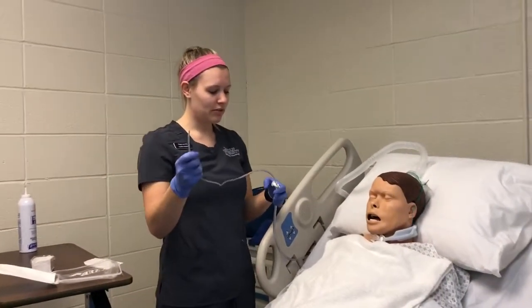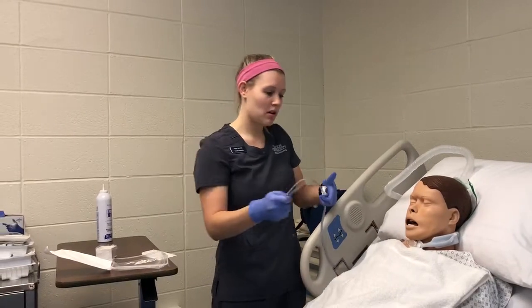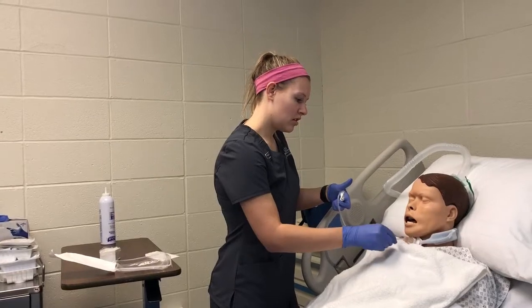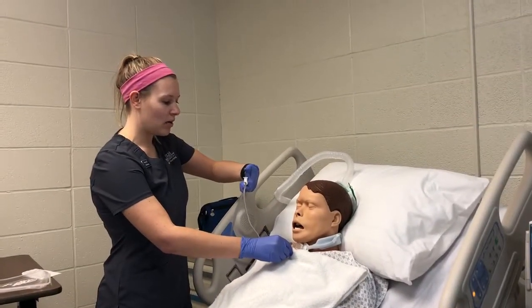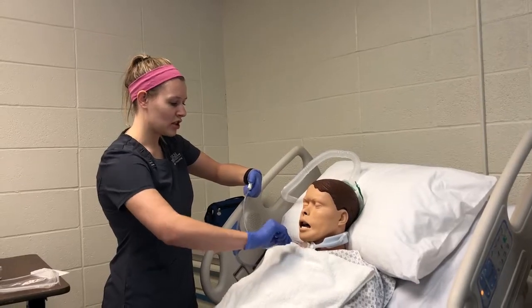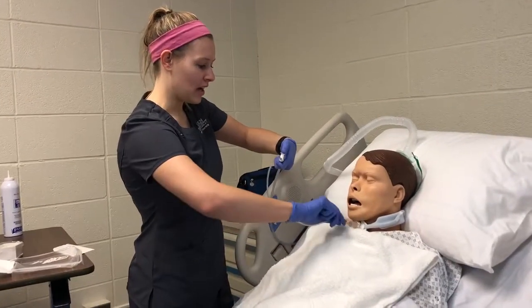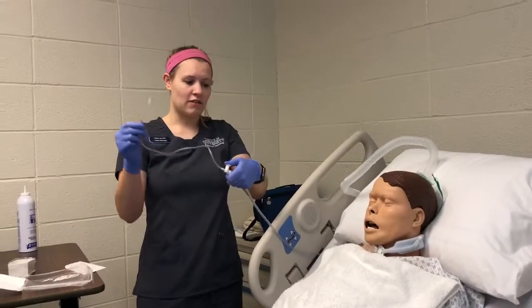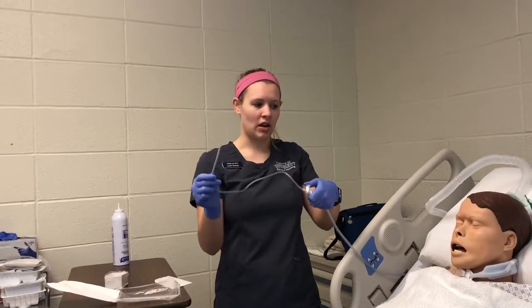And I want to make sure that whenever I'm going down, I'm not applying any type of suction, which means my thumb is up. I'm going in. Patient might start to cough at this time. And then when I'm coming out, I want to intermittently suction while turning my suction catheter so that I get all edges of the trach, and there are little holes on the side that will get all of that.